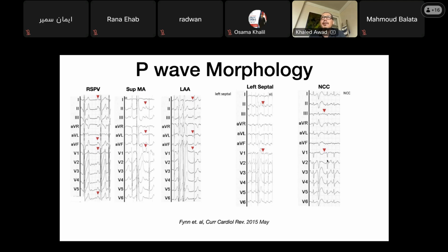Because we can then essentially have access to that part of the septum. So for most of these, in my opinion, you can go to the left atrium and you will have a much, much better lock and an easier way to map them. Sometimes you have to approach it from both sides, from the atrial side and from the non-coronary cusp side, especially if it is intramural, if there's a lot of scar and whatnot.